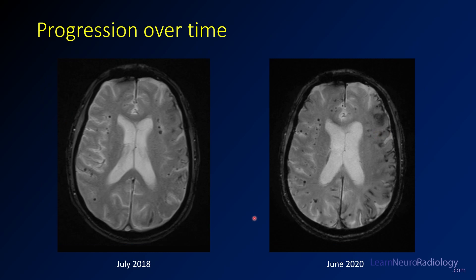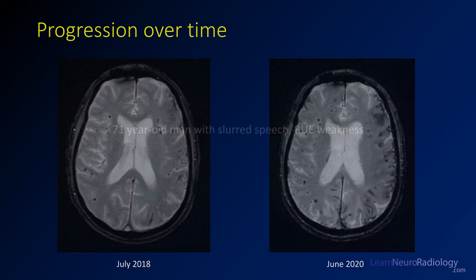Here you see this patient's progression over time. In July of 2018, there were scattered hemorrhages, mostly peripheral. Within two years, the number of peripheral hemorrhages had more than doubled, and the amount of superficial siderosis over the left hemisphere had increased pretty drastically as well.